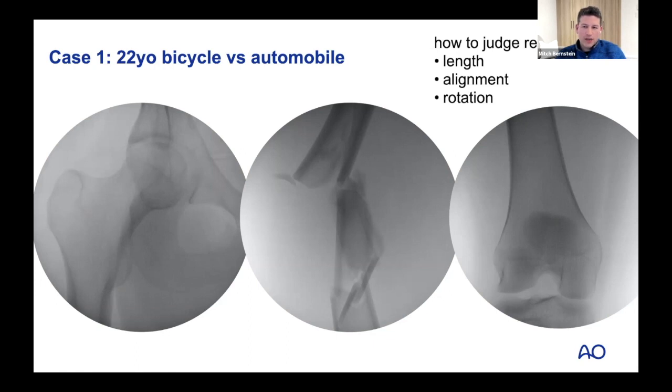Entry point and trajectory. Just like doing a total knee with an intramedullary referencing guide, the anatomic axis or the medullary canal pops out collinear with the medial tibial spine. So if I put you, Matt, inside the femoral diaphysis and had you come out at the knee, you'd come out at the level of the medial tibial spine or the PCL insertion. So with a piriformis entry, I need to exit collinear with the medial tibial spine, with like an 82-degree angle.